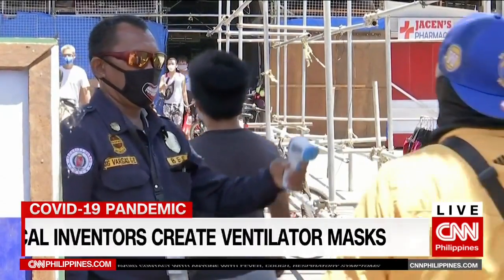Gentlemen, we would like to thank you for coming up with these ventilator masks and the healthcare masks, and we wish you all the luck in your future inventions. Arnel Andal and Edsel Orense.